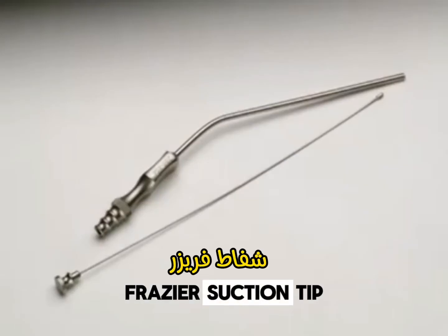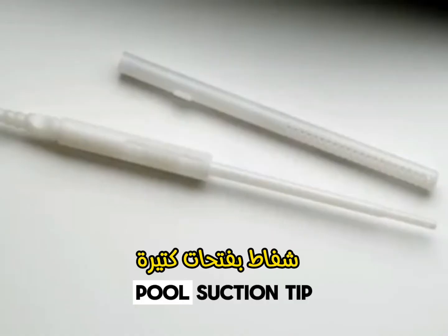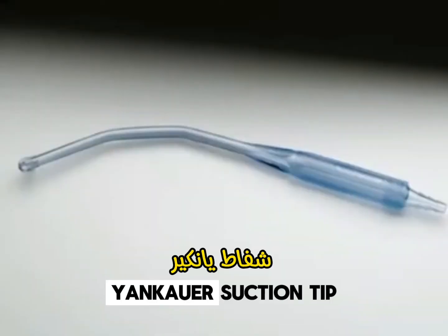Gelpi Retractor. Frazier Suction Tip. Pool Suction Tip. Yankauer Suction Tip.